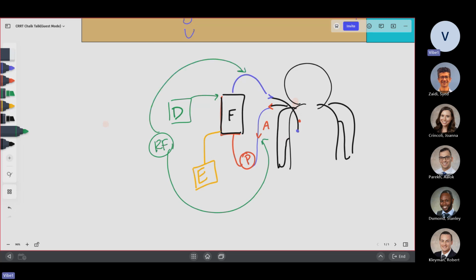Now, the reason why this matters is that if you add it pre-filter, you're going to dilute the fluid more. And when you dilute the fluid more, you're going to get less clearance. However, your filter is going to last longer because it's not going to clot up the filter as much. So you'll get less clotting if you add it before, but then you get decreased clearance. And if you add it post, you'll get more clotting because the initial fluid coming into the filter is not going to be as dilute. But because of that increased clotting, it's not going to last as long.